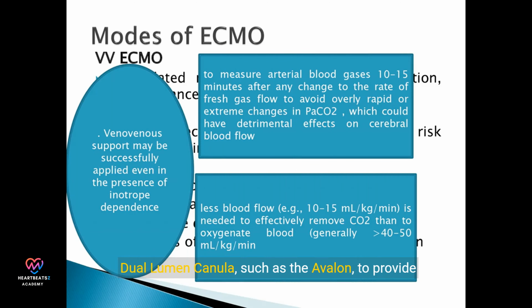The history of ECMO dates back to the 1970s. It has evolved significantly over the years, with advancements in technology and clinical practice. Esperanza, a notable case in ECMO history, demonstrated the potential of this life-saving technique. It paved the way for further developments in ECMO therapy.